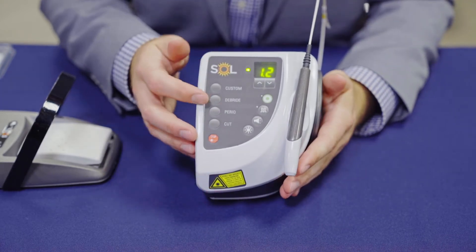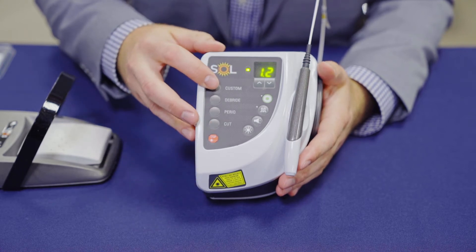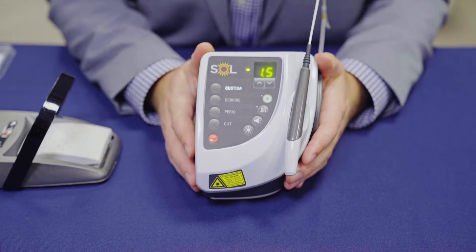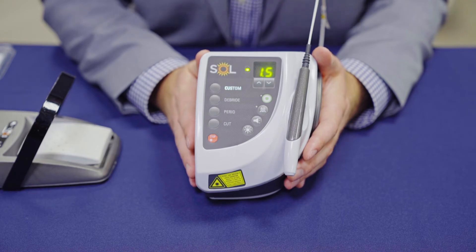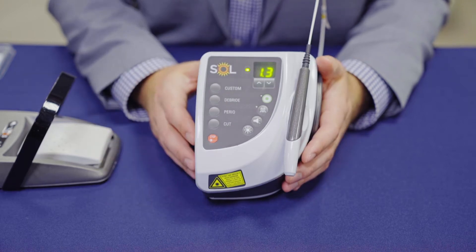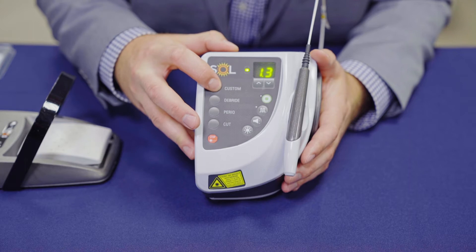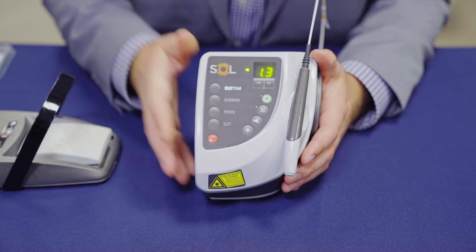The first buttons you see on here are the preset buttons. Your first preset is known as custom. When you press the custom button, it comes preset from the factory to 1.5 watts. You can easily adjust this up or down using your keypad. If you'd like to save it as a new preset, simply hold the custom button for three seconds and you'll have a new preset.